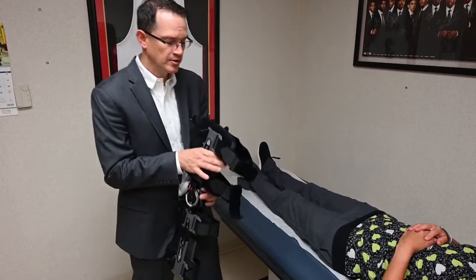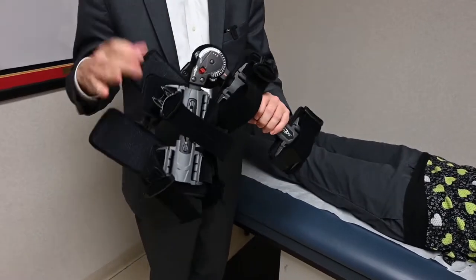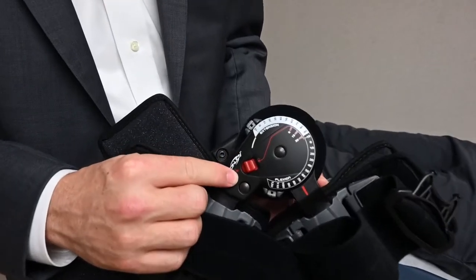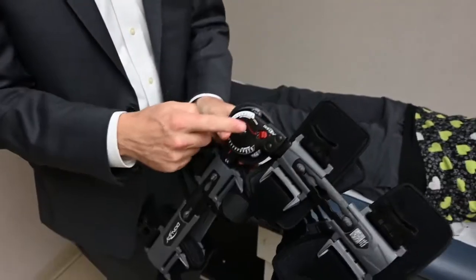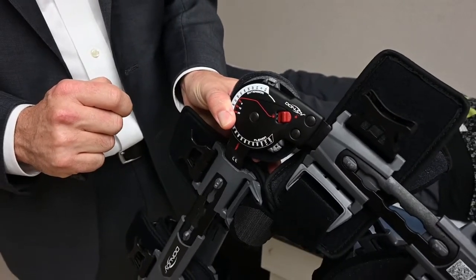In order to apply the brace, I recommend that the brace is initially unlocked. To unlock the brace you simply switch the red dial from the locked position to the unlocked position. There is a switch on both hinges, so you want to make sure that both are unlocked before applying the brace.